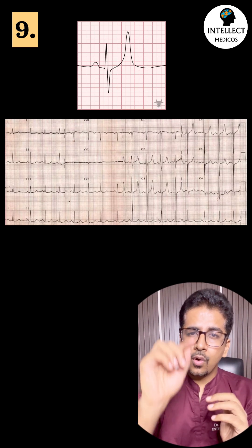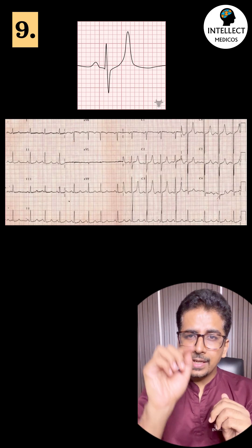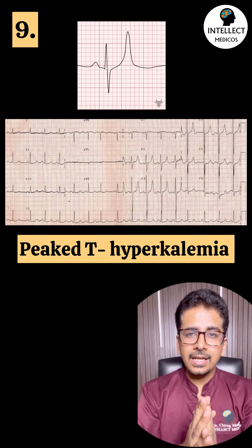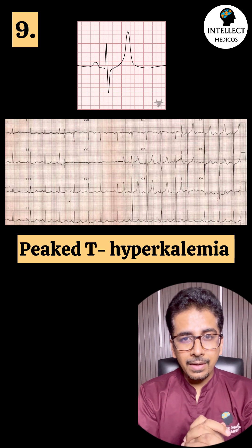Ninth: there is tall and peaked T-wave, which is very commonly seen in hyperkalemia.